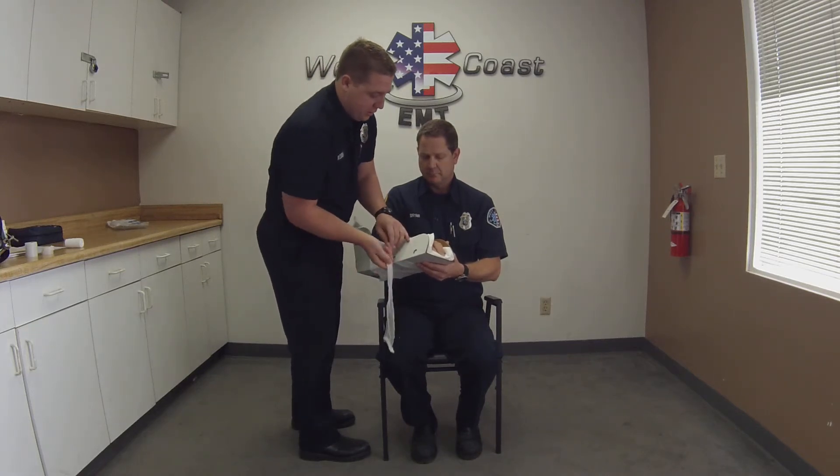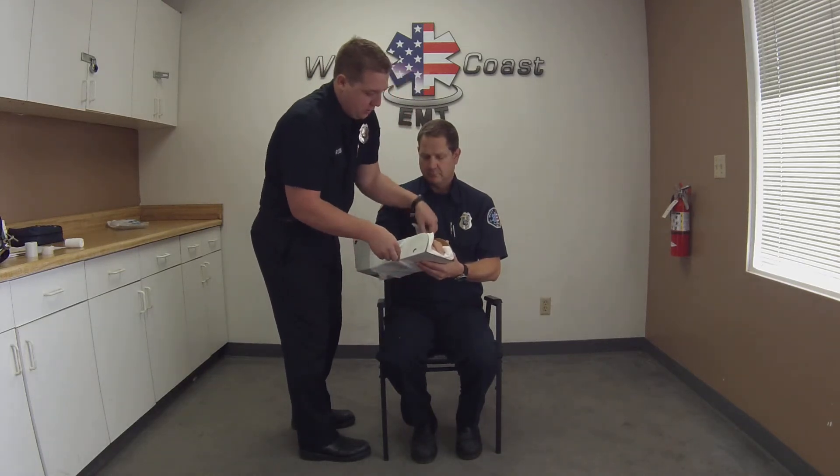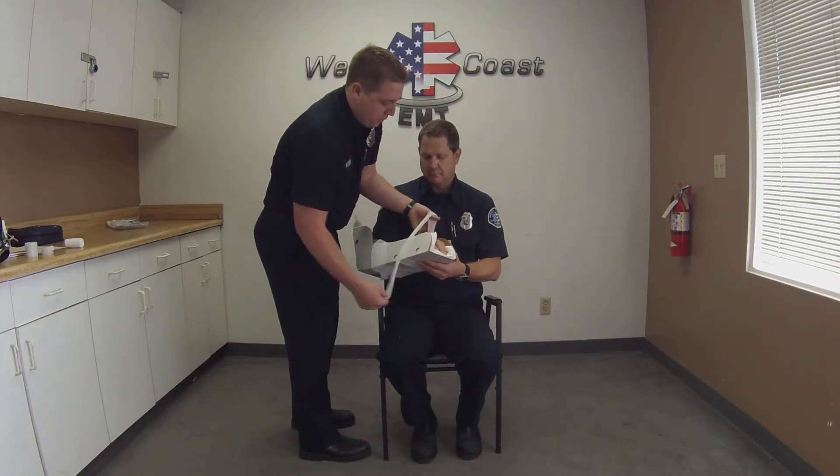To secure this dressing in place I can either tape it or go ahead and tie a nice little knot. Either one will work just fine.